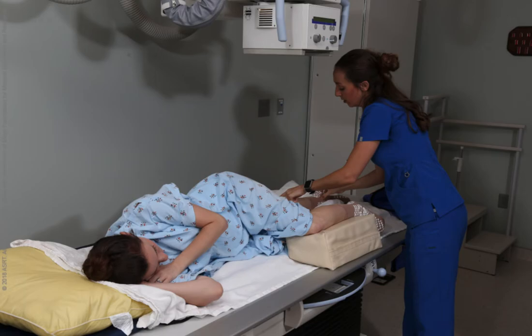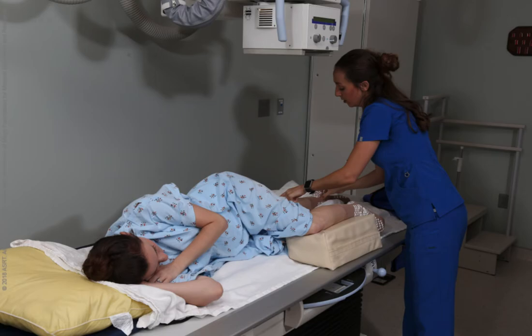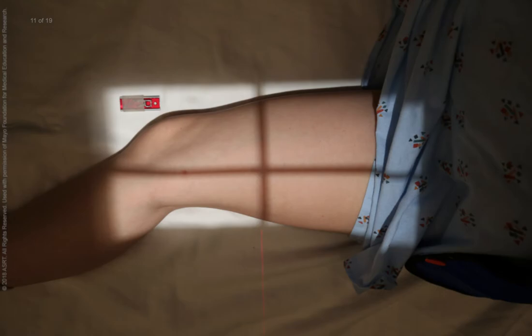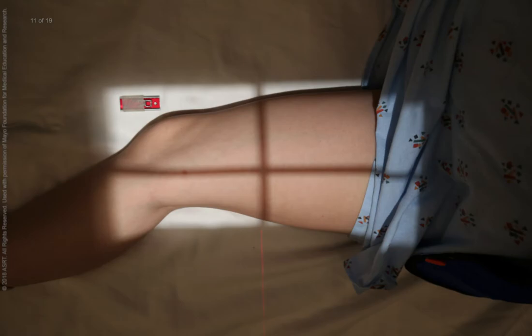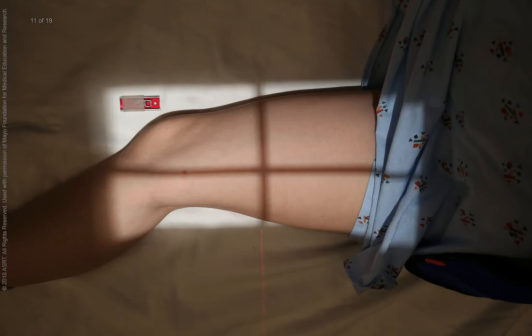Make sure the pelvis is in a true lateral position. A sandbag or positioning sponge is placed under the ankle and the patient's body position is adjusted until the femoral epicondyles are perpendicular to the plane of the image receptor. The bottom of the image receptor is positioned 2 inches or 5 centimeters below the knee joint. The central ray is directed perpendicularly to the midpoint of the femur and the center of the image receptor. If the patient can't be turned onto the affected side due to a suspected fracture or destructive disease, a cross-table lateral projection can be performed with the patient positioned supine and the central ray directed horizontally. Anatomical markers are placed on the image receptor to identify the anatomical side being examined. The patient's gonads are shielded and the shield is placed between the x-ray source and the patient. The patient is instructed to hold very still, but no breathing instructions are necessary.